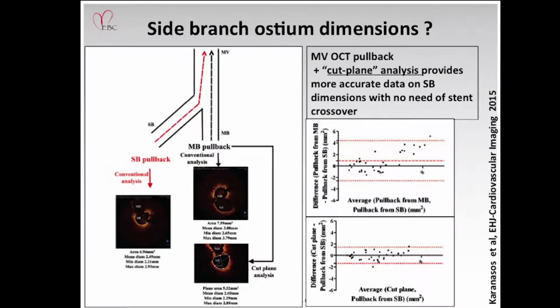Another, new option could be to use the cut plane analysis, which is a computer algorithm that will provide you much more accurate data on the side branch dimension.